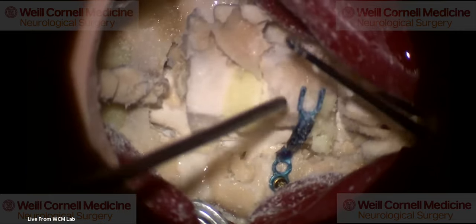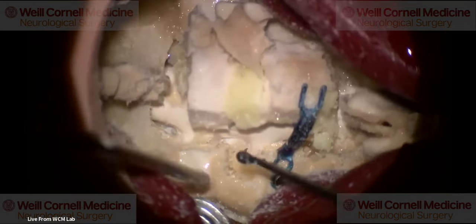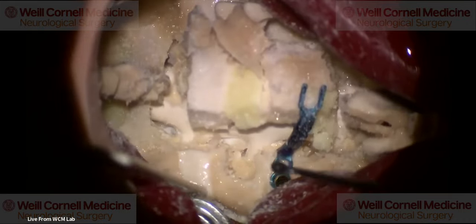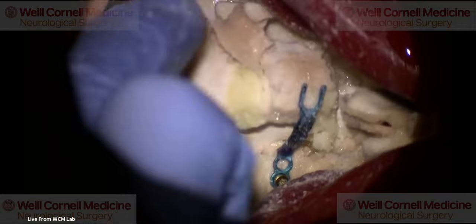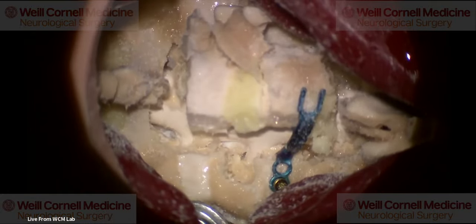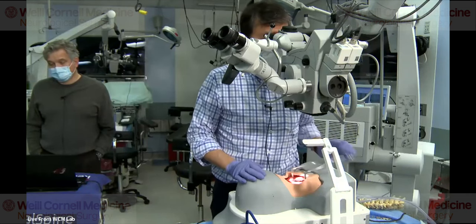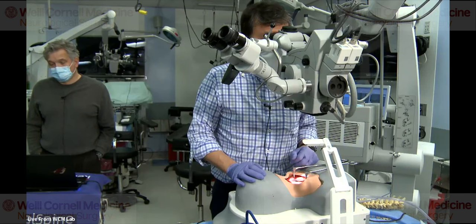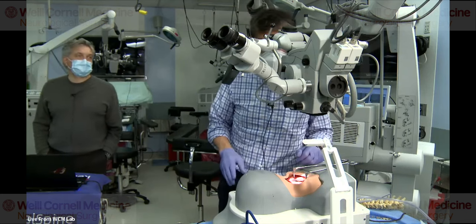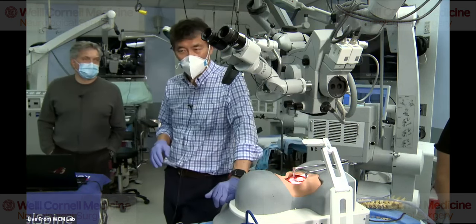And then the final thing to get hemostasis, I put some SurgiFlo or FloSeal on the sides. I put some SurgiCel on the sides, and I take a SurgiCel Snow and put it over. I could just kind of tamponade, throw the antibiotic in, and then ask the plastic surgeons to close. That way it bleeds very, very little postoperatively. And all that hemostatic agent, if you ever go back in on a patient like that, within about 24 to 48 hours, it's all gone. The body just absorbs all that cellulose and everything else.